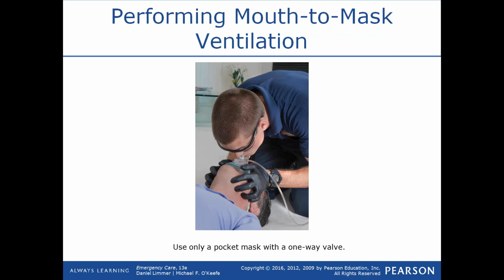So here's a picture of the thenar technique, where the person is using their thumbs along the top of the mask to seal it to the patient's face, and then using their own lungs to ventilate the patient.